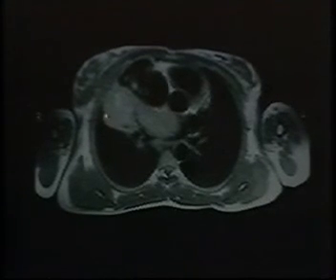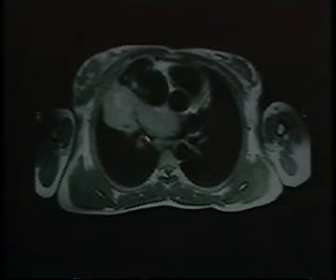This was a patient with a carcinoma of the right lung, and on echocardiography was found to have a big mass in the left atrium, and that's exactly what we see here. When the surgeon saw this MR, he just figured the patient was inoperable. Dr. Ziffert, at our institution, who was a radiologist, saw the left atrial wall here, and he raised the possibility that this tumor is simply growing in through the pulmonary vein and may be resectable.